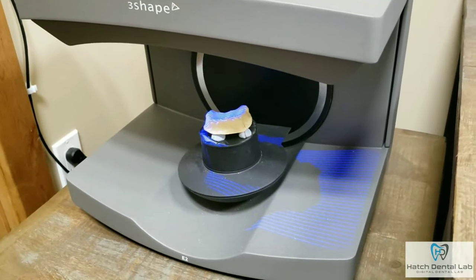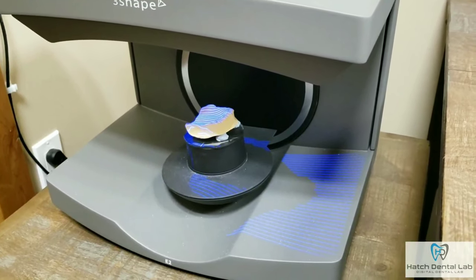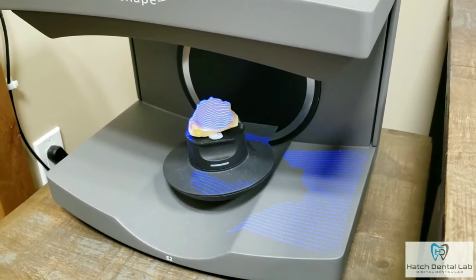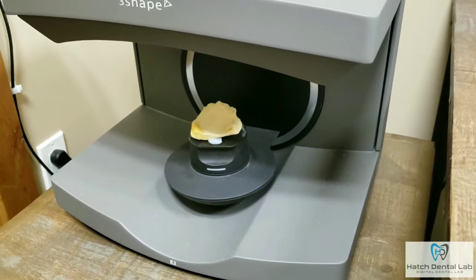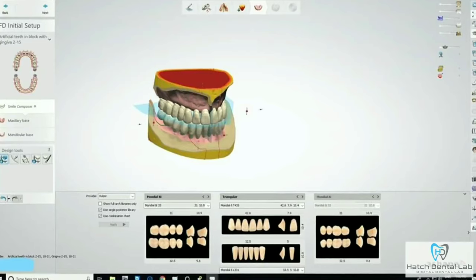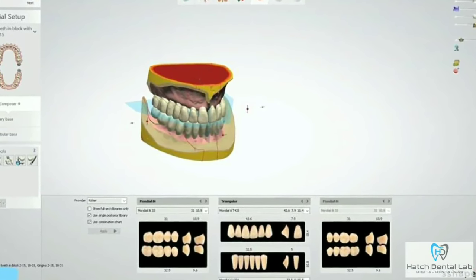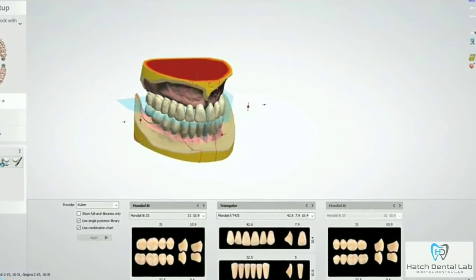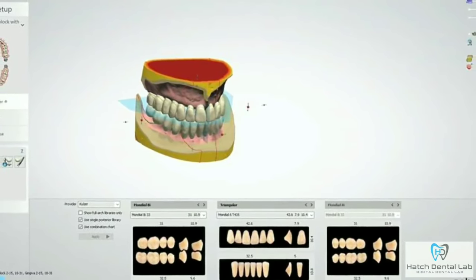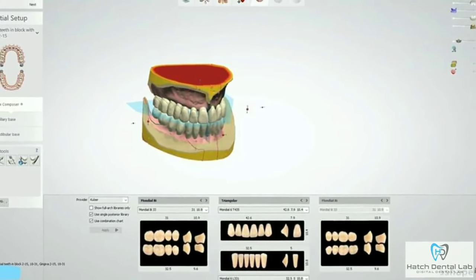To start the process we use a 3Shape scanner which takes an extremely accurate scan so the denture will fit perfectly. This scan is within 10 microns of accuracy — that's one-tenth of a human hair. We then design the case using 3Shape software, making it so we can have perfectly balanced occlusion. The software allows us to shorten the denture process without sacrificing any quality. Your chair time will be greatly reduced in the denture fabrication process.